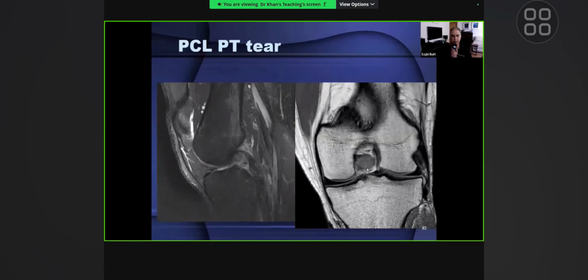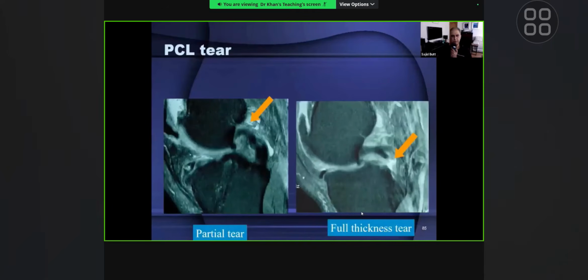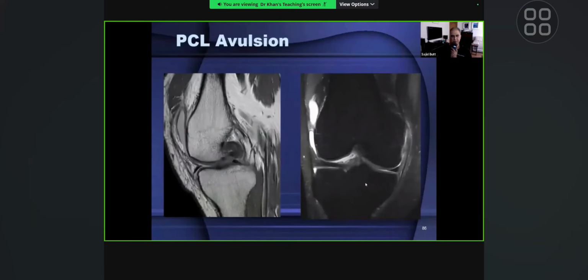It can result in a globular swelling of the ligament fibers. You can get mucoid degeneration with big meniscal, ligamentous ganglion cysts within it. And you can get disruption of the ligament fibers from the femoral attachment and in the mid substance.